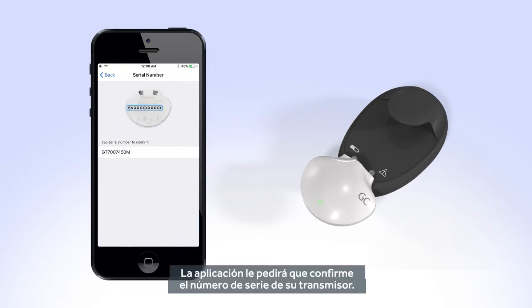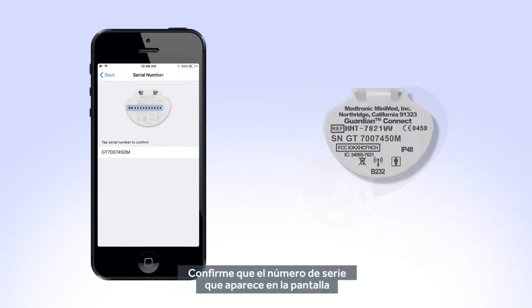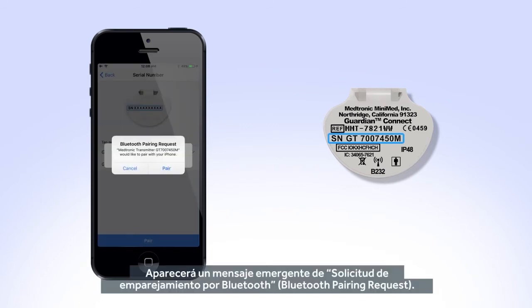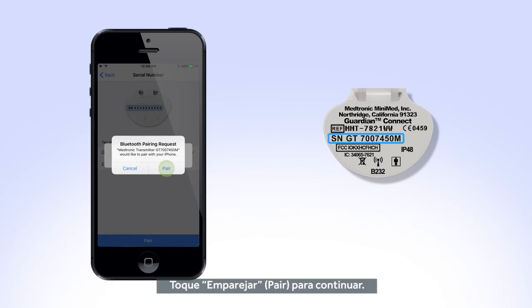Your app will ask you to confirm the serial number of your transmitter. Confirm that the serial number on the screen is the same as the one located on the back of your transmitter, tap the serial number on the app screen and select Pair. You will receive a pop-up message for a Bluetooth pairing request. Tap Pair to continue.